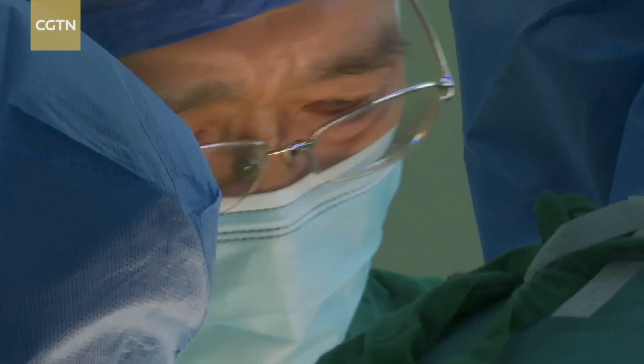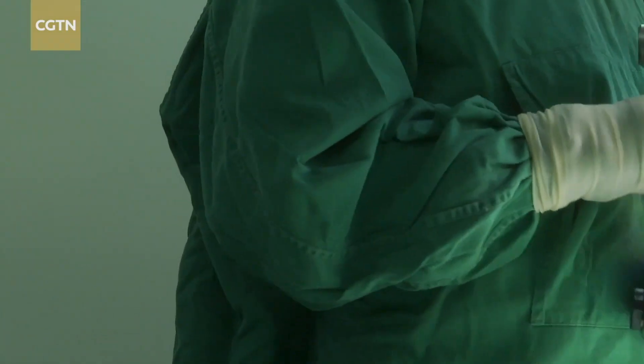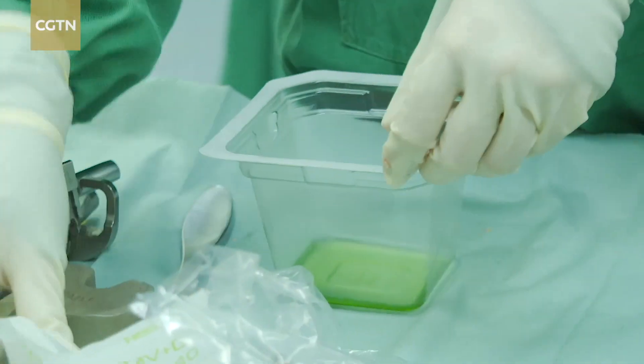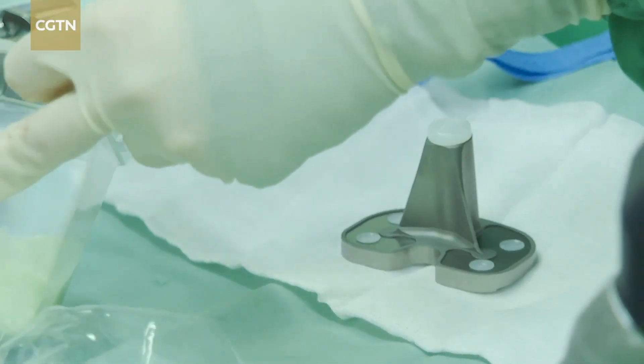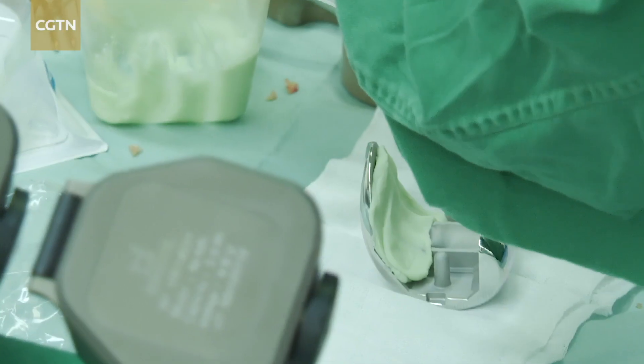Chinese doctors are improving the procedure for full knee replacement surgery. With CT and MRI information, they can custom make artificial knee joints as well as surgery equipment for each patient. This kind of personalized treatment comes thanks to a breakthrough in 3D printing technology.